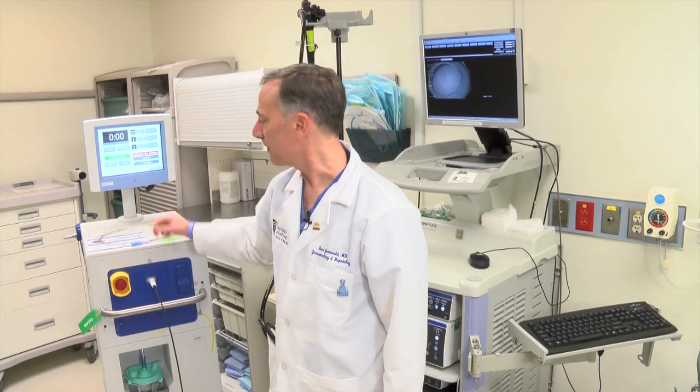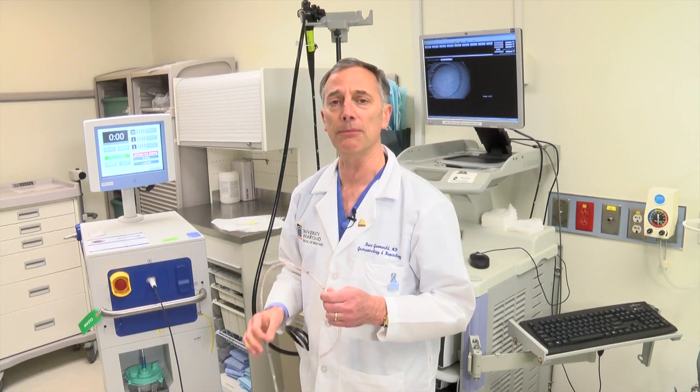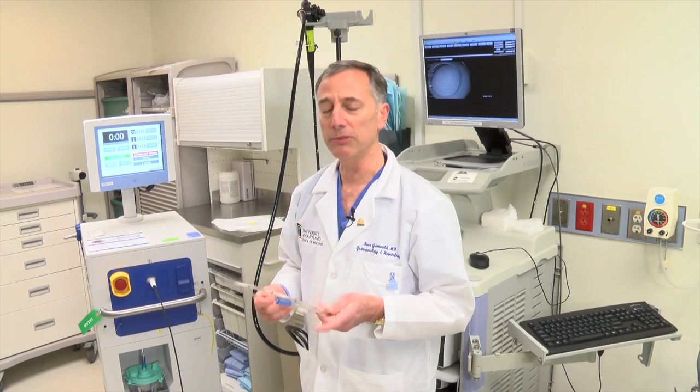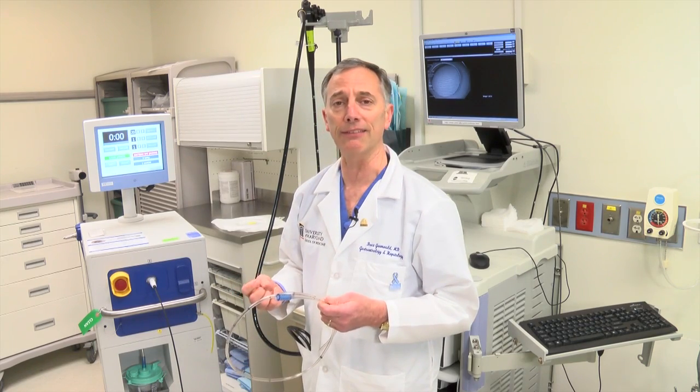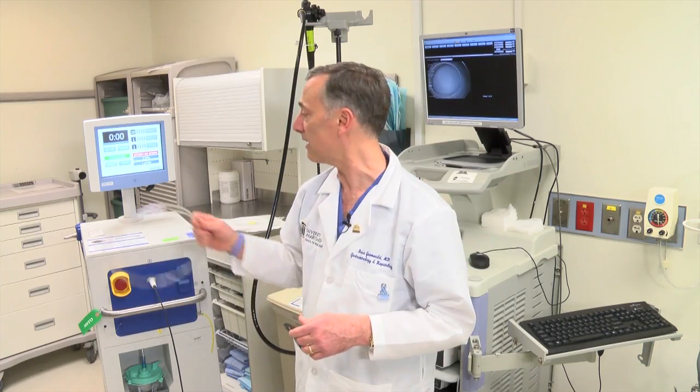The catheter is here. Prior to performing spray cryotherapy, we do a routine upper endoscopy and identify the area that we want to treat. Next, we pass a stainless steel guide wire down into the stomach and then use this cryodecompression tube, which is a modified type of oral gastric tube. This is placed over the wire into the stomach, and the wire is then removed. This tube is used to decompress the evaporated nitrogen gas that forms as the liquid nitrogen spray increases in temperature. This decompression tube is hooked up to a canister, and there is an included suction device within the console that maintains suction throughout the treatment.